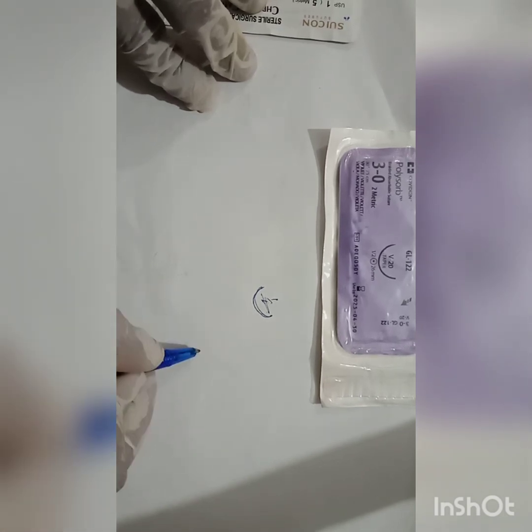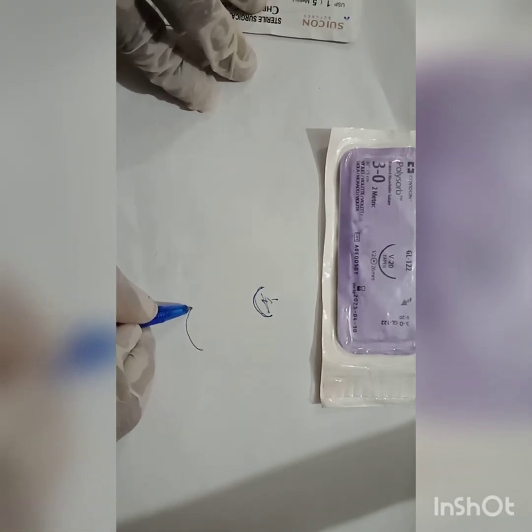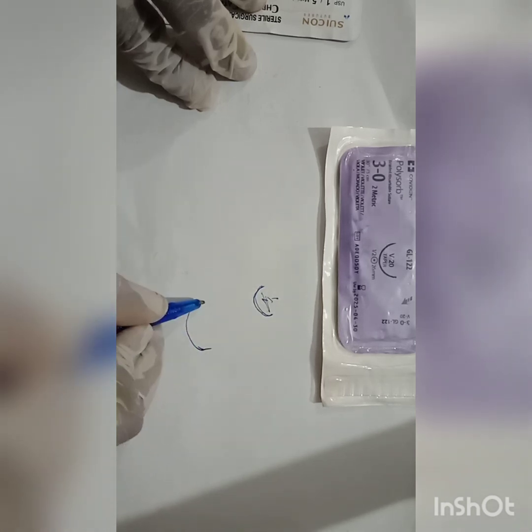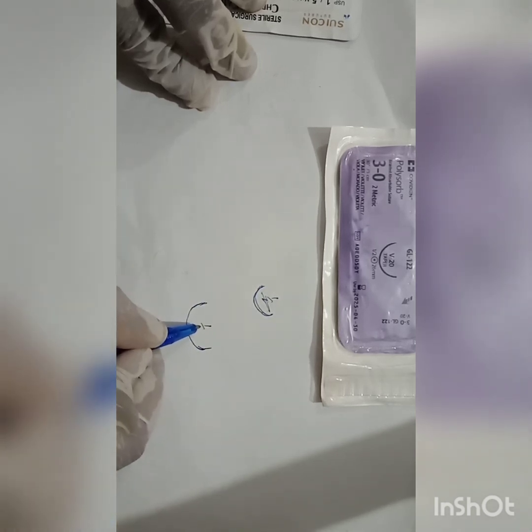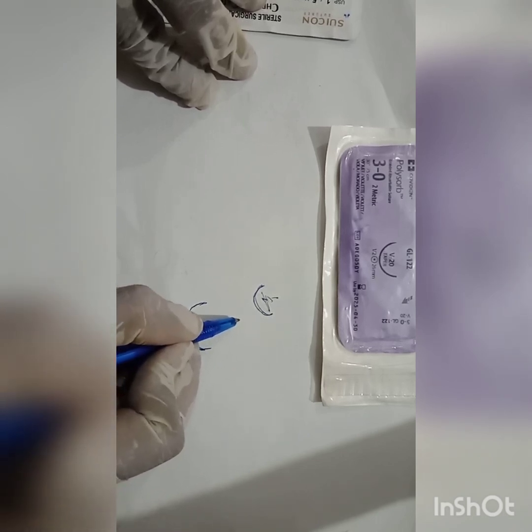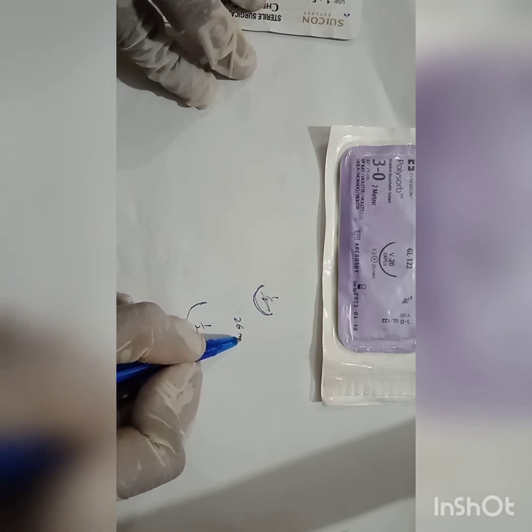So suppose any needle which forms 1/2 of the circle, and suppose it is 26 mm.